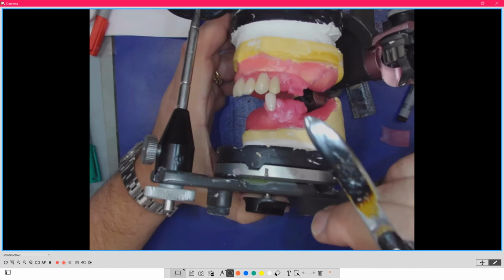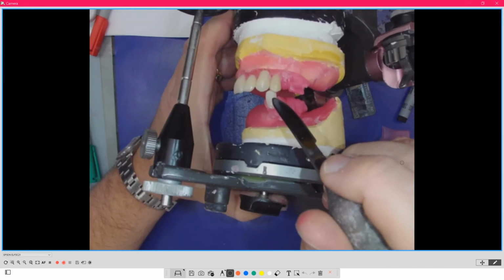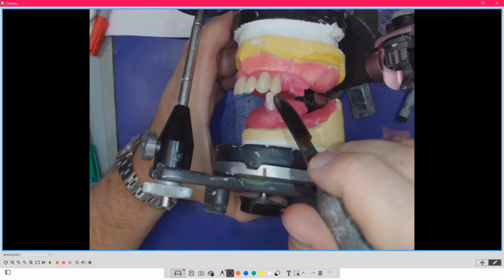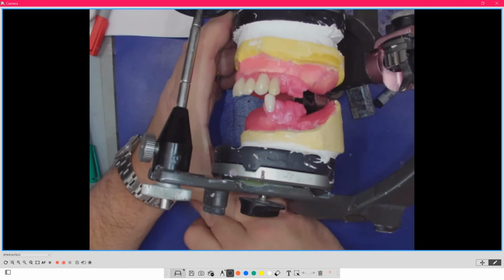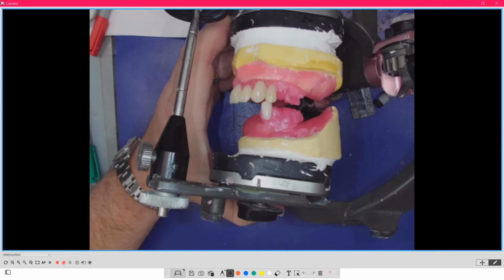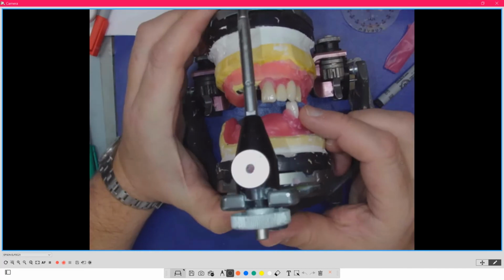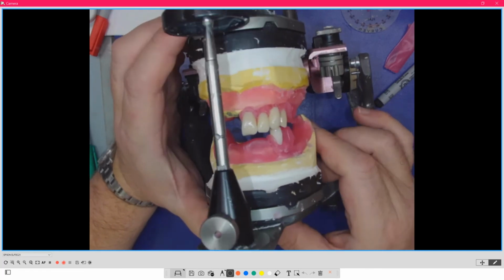So let me explain this. Typically, if this was a 20-degree tooth or a 30-degree tooth, etc., I'd have to have it interdigitate like this, or it wouldn't work. Now I want you to draw back to the chew cycle and remember where all the contact was. Well, it was in the molar area, the first molar, second molar specific area. So now what I can do is take this tooth and actually push it in lingually. Now, what did that just do?